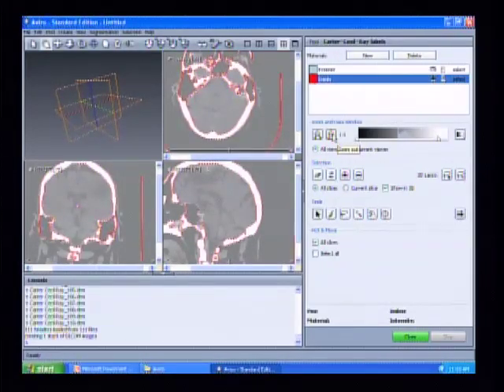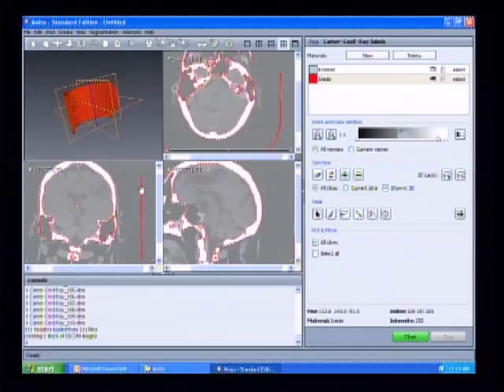What I want to do first is remove that area, that metal, or whatever that material is that's laying in the back of the patient's head. So if you use your pointer tool, you can click. It's probably easiest to see in this bottom left view. You want to click as closely and as accurately as you can into this small little red line.